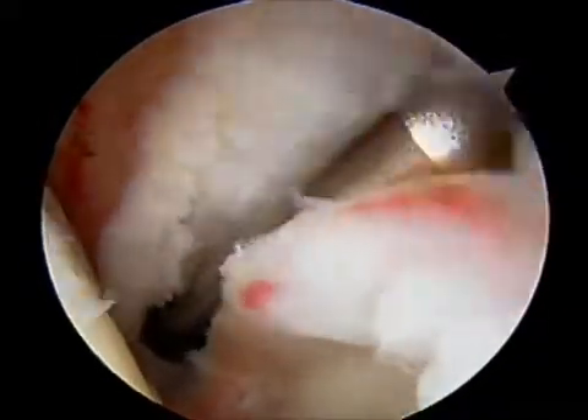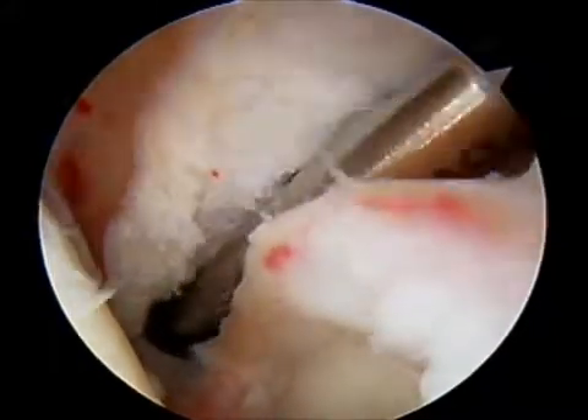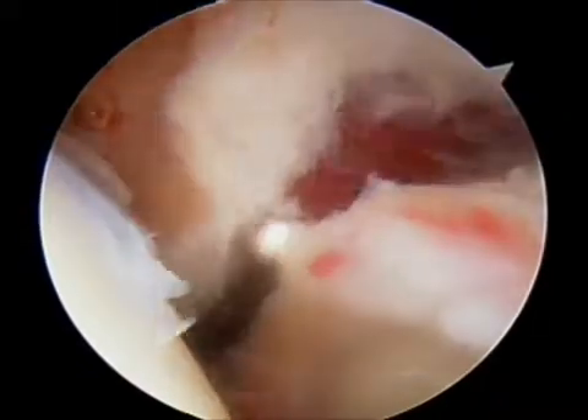Once the ligaments have been completely released, the arthroscope is removed from the shoulder. The shoulder is manipulated to ensure that there is full range of motion, and then the patient is referred to physical therapy which commences the first day after surgery and continues five days a week for the first three weeks postoperatively.